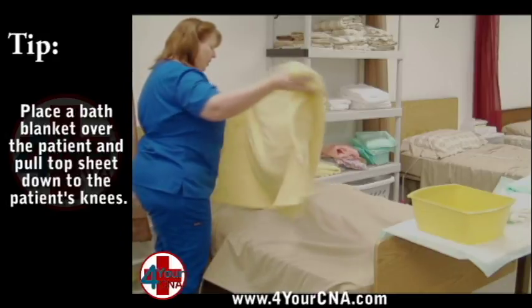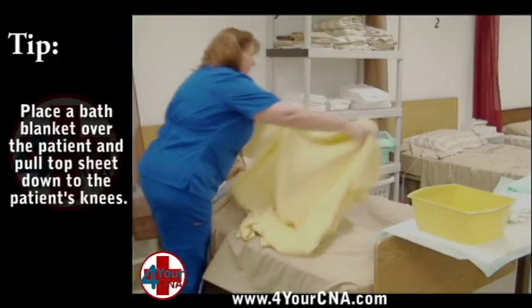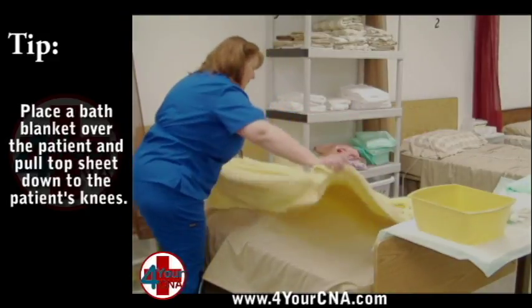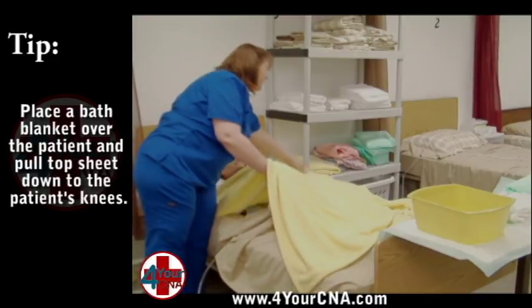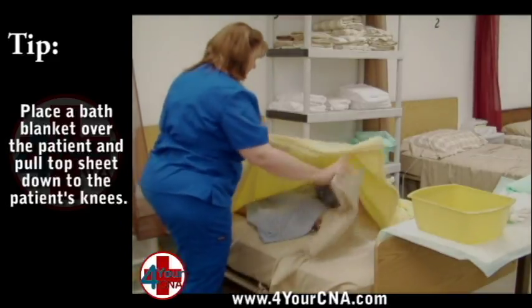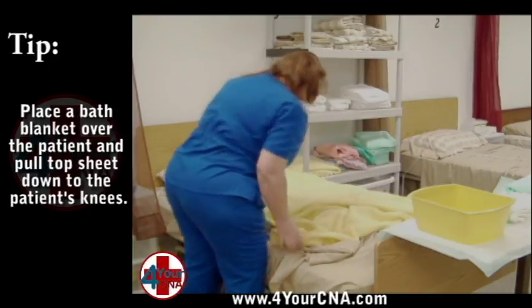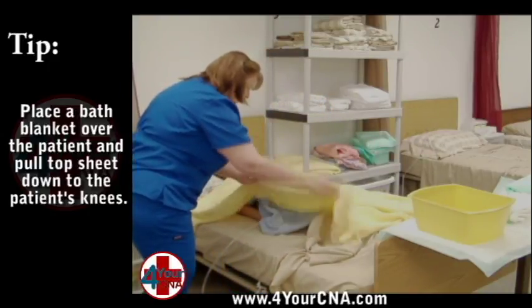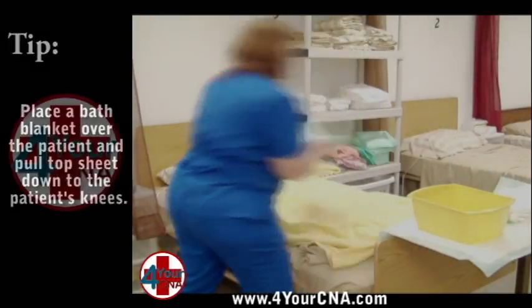Ensure that you are explaining what you will be doing before performing each step to help the patient feel more comfortable. Carefully unfold the privacy blanket over the patient's top sheet. Do not snap or shake the blanket. Instead, carefully spread the blanket out over the patient to provide privacy and keep the patient warm during the skill. Have the patient hold the blanket in place while pulling the sheet down under the blanket to the patient's knees.